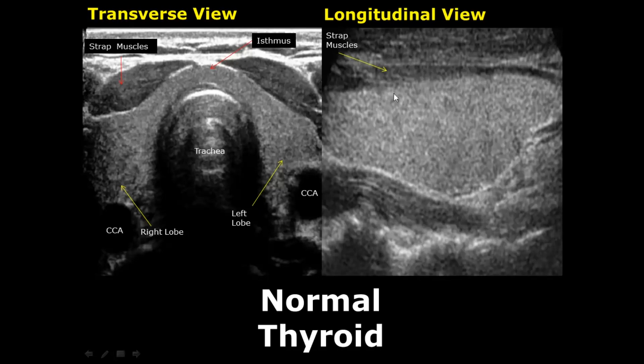These anechoic regions are the common carotid arteries seen in cross-section.